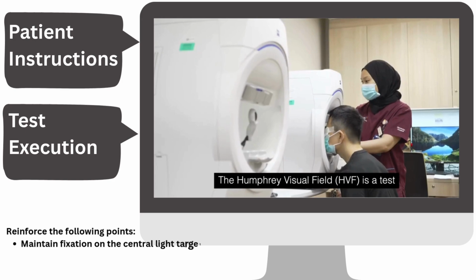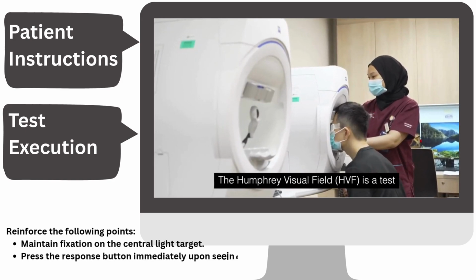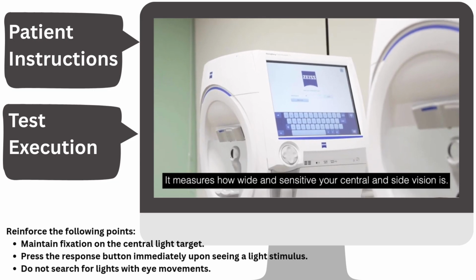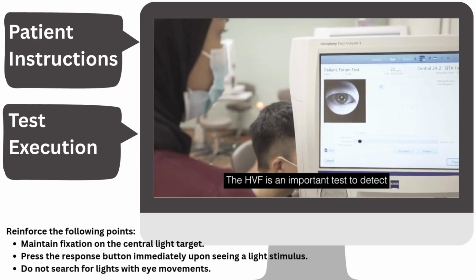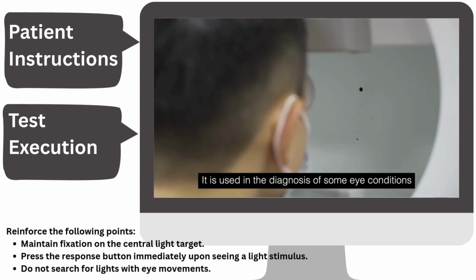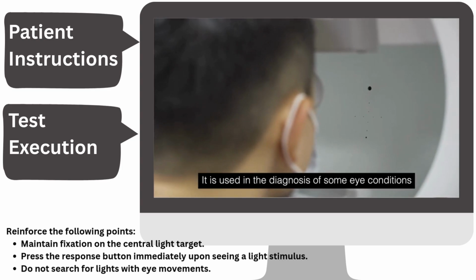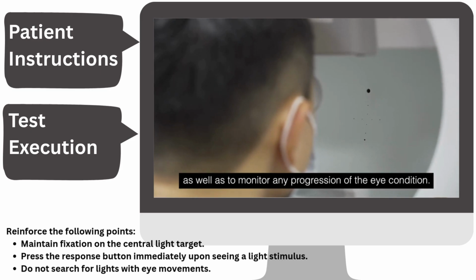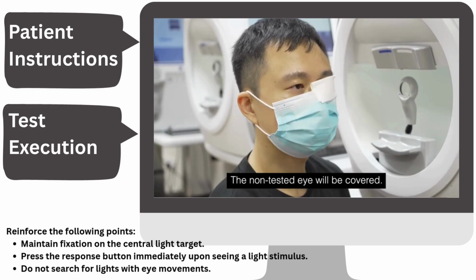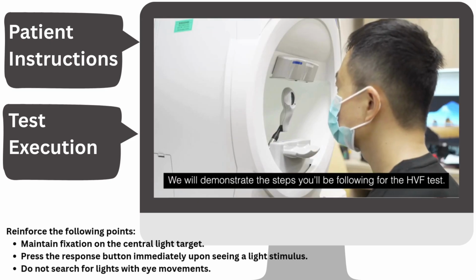The Humphrey Visual Field, also known as an HVF, is a test performed to measure the quality of your visual field. It measures how wide and sensitive your central and side vision is. The HVF is an important test to detect any changes to your extent of vision. It is used in the diagnosis of some eye conditions as well as to monitor any progression of the eye conditions. This test is performed in a dark room, one eye at a time. Test duration for each eye is about 5 to 10 minutes depending on the type of test that has been ordered. The non-test eye will be covered. We will demonstrate the steps you will be following for the HVF test.